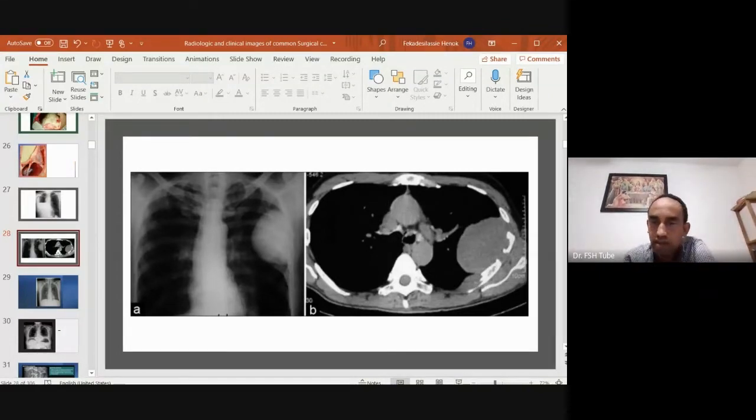Empyema, it could be a loculated empyema, a mass, excellent, a pleural-based mass, excellent. Mass on the left, excellent, mesothelioma, excellent. So you see it's hanging high up in the thoracic cavity, right? Now, loculated fluid has a typical characteristic, if there was something going on, inadequately treated, yes. But most probably, you see it's a pleural-based mass, right, there is also some component here.